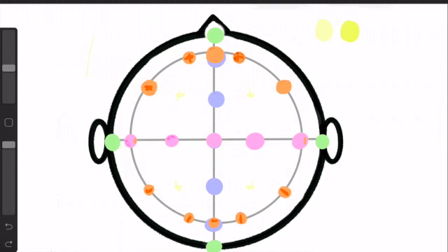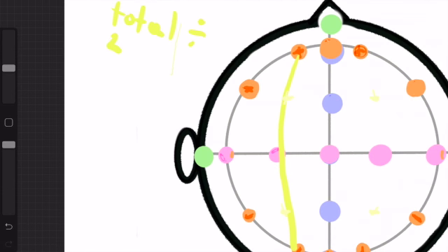Okay, so the fourth section of measurements is sagittal. You can think of sagittal lines as the red lines on a baseball. So we're going to start off on the left side and we're going to find the points true C3 and the new points F3 and P3.